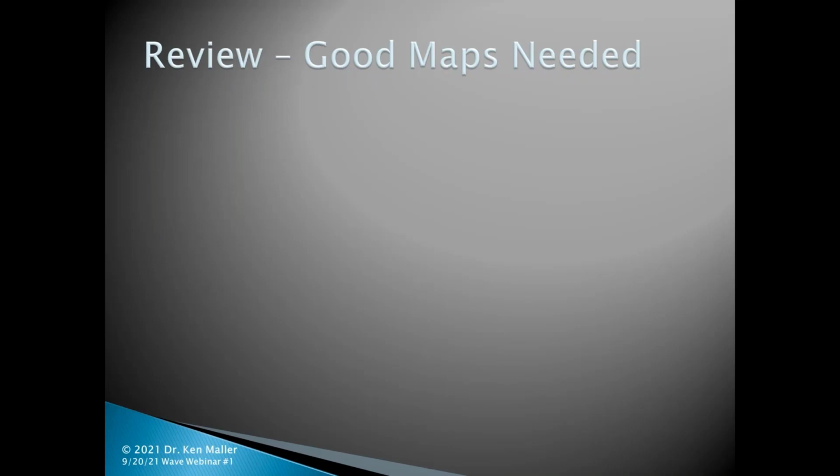But that was the only place that the Pentacam actually captured on this eye. Now, on the other eye, it captured it perfectly centered exactly where I expected it to be. And so when I took a look at the map, I was very suspect of the data that it had provided to me to design up the lens.